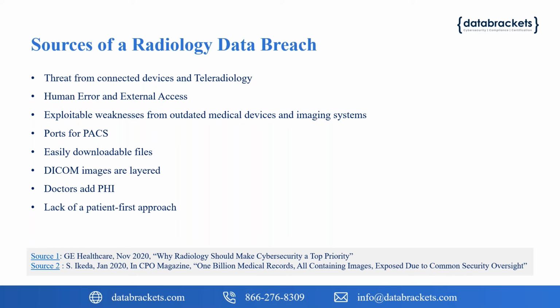And then also the DICOM images are layered. What we mean by that is they do have some standards for the DICOM files that are generated to create the patient-specific information, whether the reference number or the record number that associates that particular image with a patient, and also to add some tags very specific to the patient.